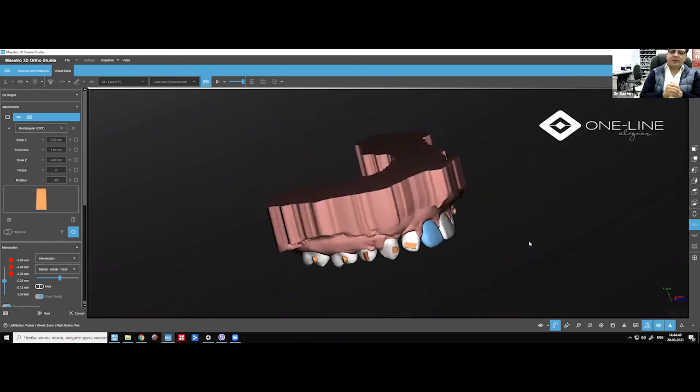Why? Because for any movement, if you want to move this, right? If you are down and you have something which is going to press, it's going to be both ways, from here and from here. So the upper and the lower from here, because it is placed inside on the tooth. So this is also workable for smaller teeth.